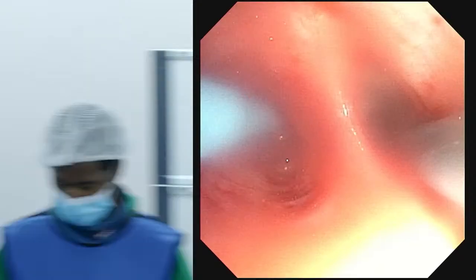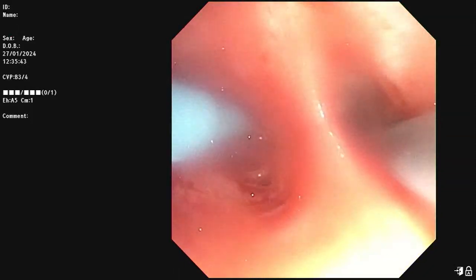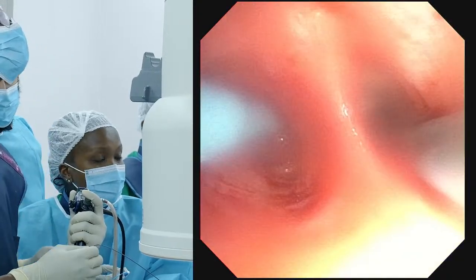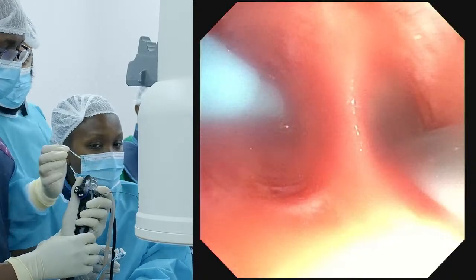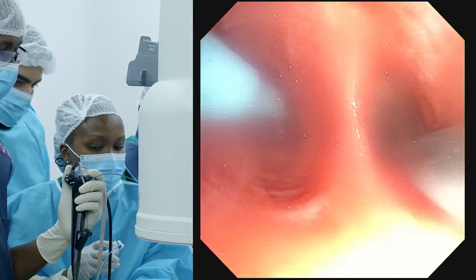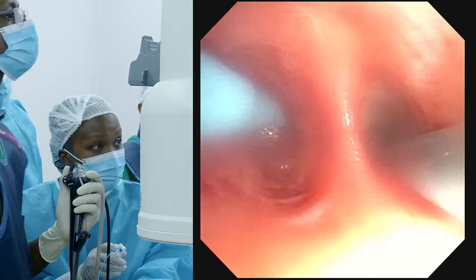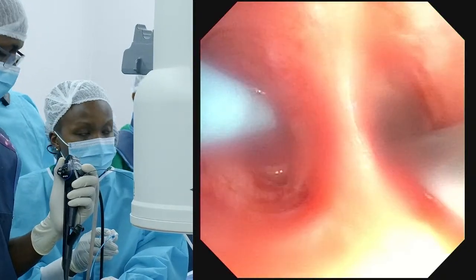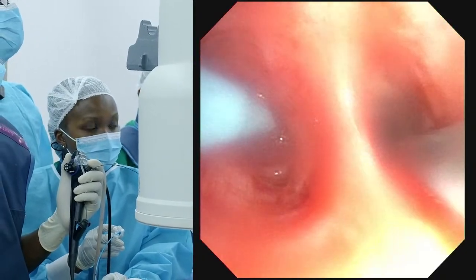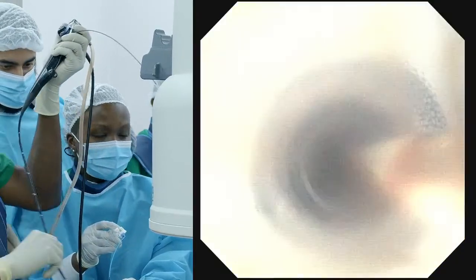You can take it a bit. That's okay, that's fine. That gray area between the 2 ribs, that's a good spot. Now, what I want you to do is, you hold that nicely like that. Now you don't have to hold that with your hand. Hold the scope here. All right. Now, focus on the pedal. When you're ready, start to freeze. And then I want you to really just jerk it out quickly. Okay? 1,000, 2,000. So go for 4 seconds and out.